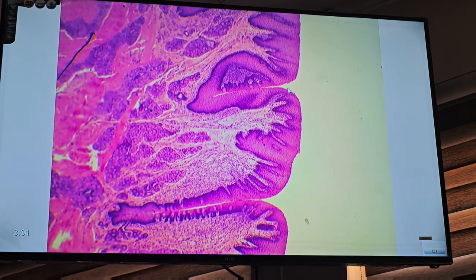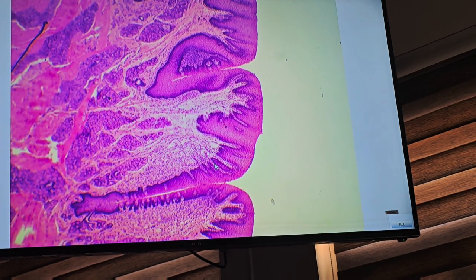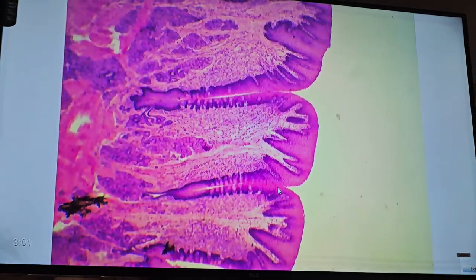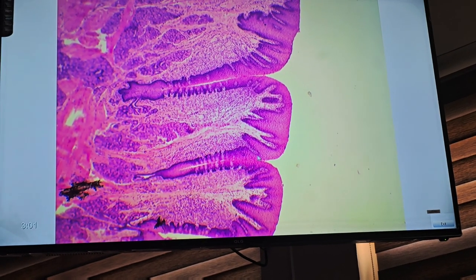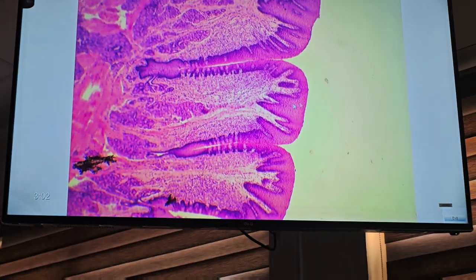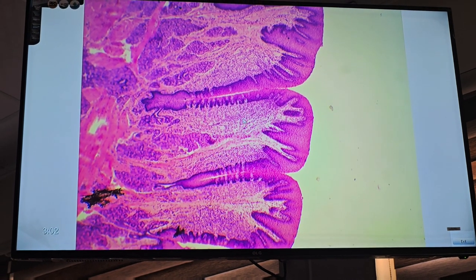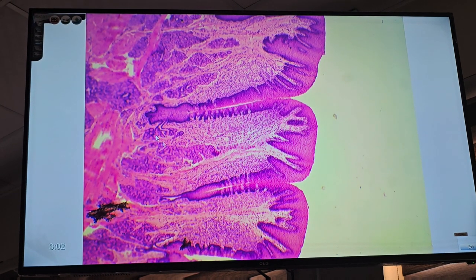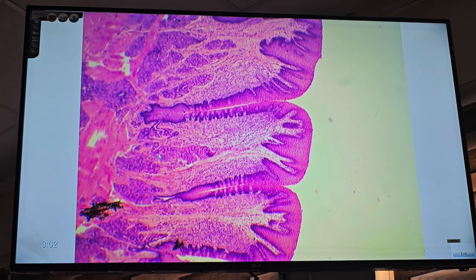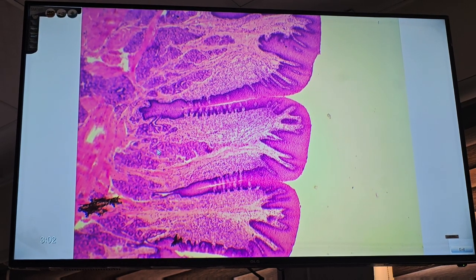This type consists of parallel ridges. Notice the parallel ridges. We will leave this for you on low power, in high low power. Parallel ridges are made of several projections. The epithelium is stratified squamous non-keratinized, beneath it lamina propria of loose connective tissue with salivary glands. Foliate papillae are rudimentary in humans, especially older individuals.